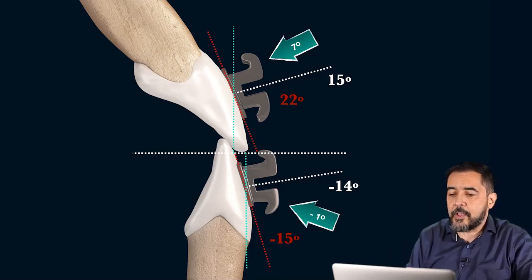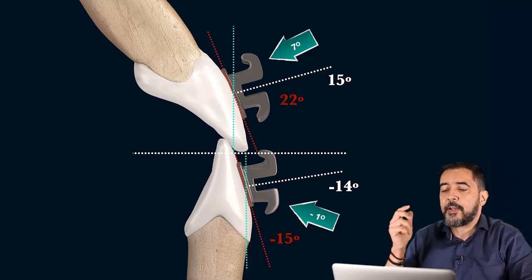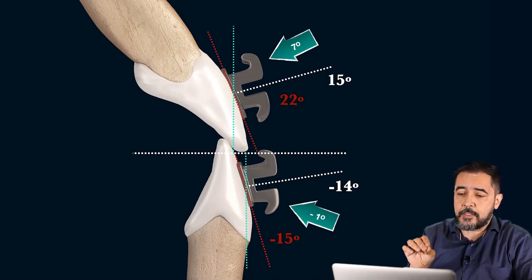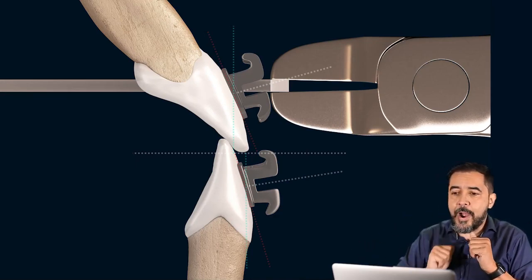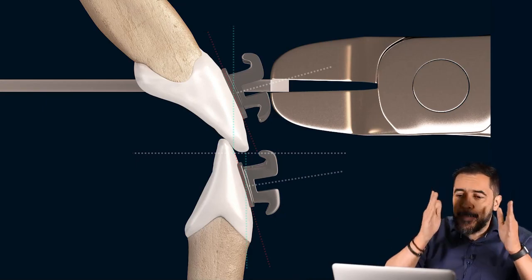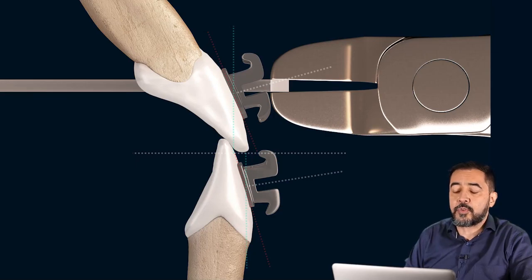The lower incisors also have a difference. We have minus 15 degrees of inclination of the crown, and embedded inside the bracket just minus 1 degree. So we have a minus 14 degree difference, okay? This is important for us because if I don't apply a torsion to my rectangular arch wire, this is going to happen to my patient. You may not have this amount of problem, but you will generate some kind of mistake in your treatment, okay?